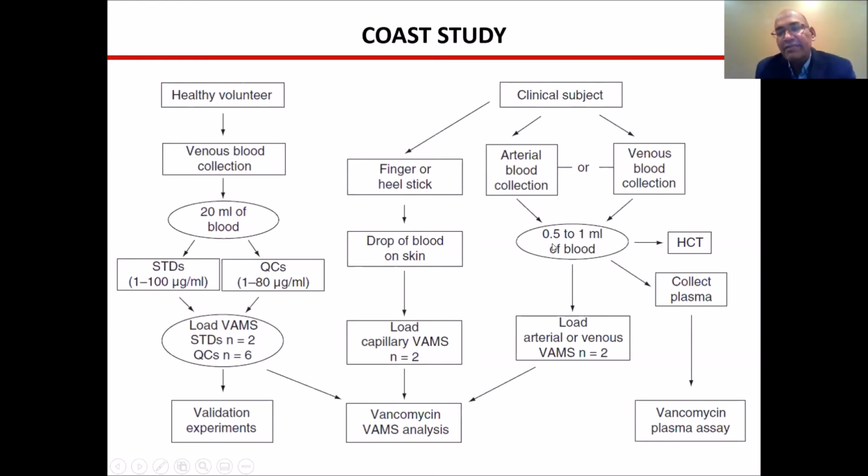a blood sample is collected from the subject and sent to the clinical laboratory, which is a CLIA certified lab, looking for plasma concentration of vancomycin for clinical decision making. We utilize that assay to compare the outcome of the vancomycin plasma assay to what we measure with this whole blood VAMS assay.